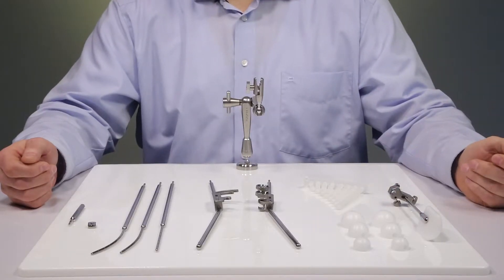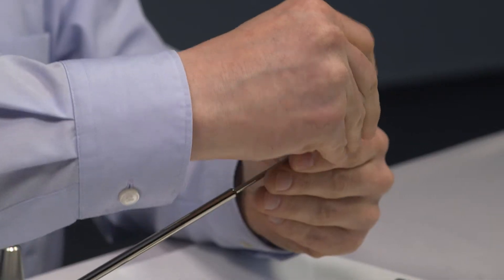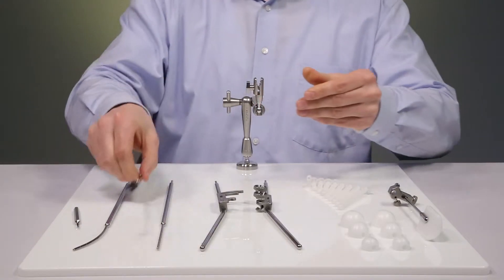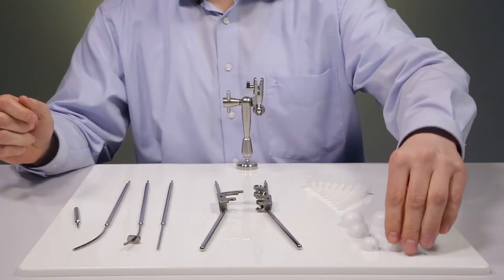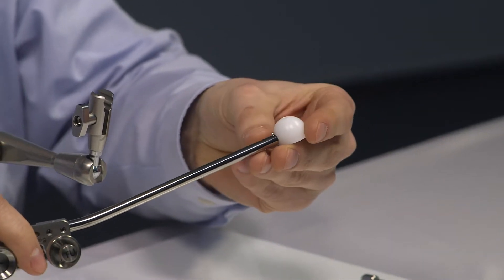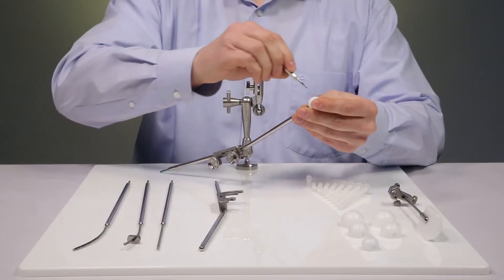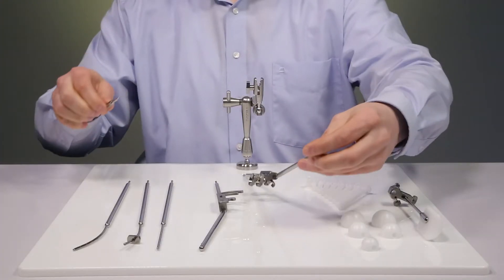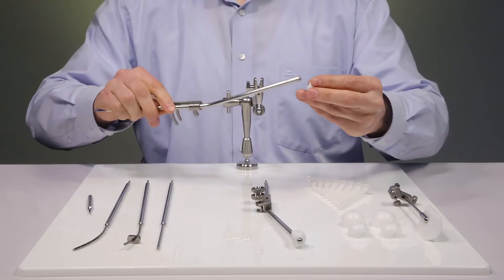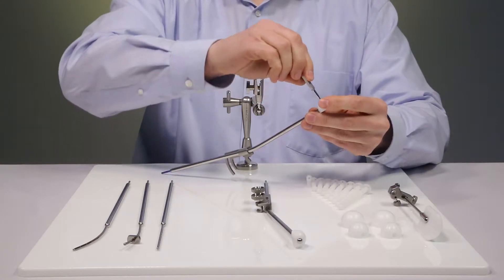Let's start with the assembly. I select an intra-uterine tube and fix the cervical stop. Now I select a 2 cm ovoid and fix it on the ovoid tube. The small pin helps finding the right orientation. The second ovoid is fixed on the left ovoid tube. The small pin also avoids rotation of the ovoid.